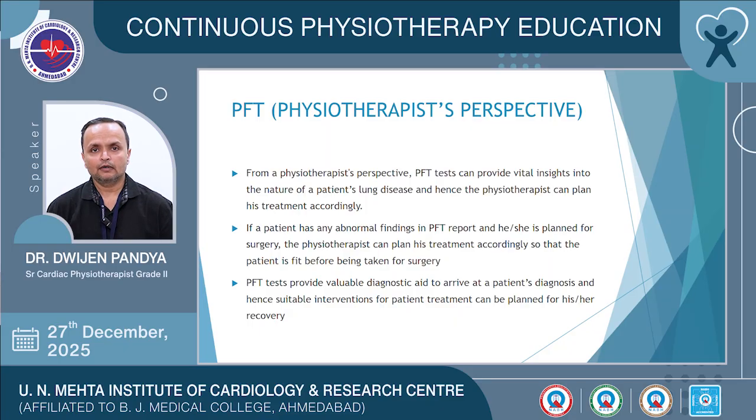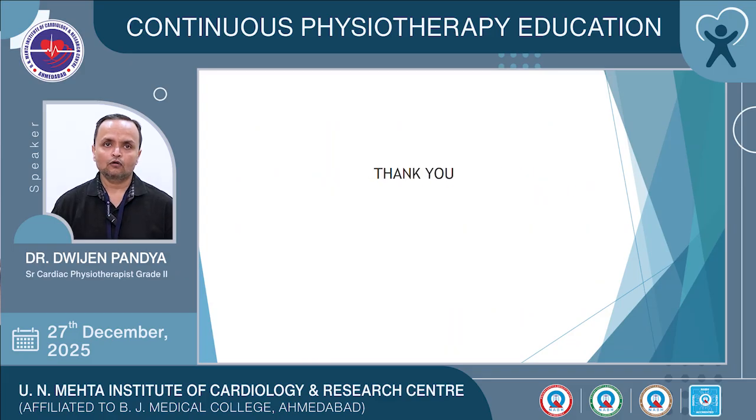PFT tests provide valuable diagnostic aid to arrive at a patient's diagnosis, and hence suitable interventions for the patient's treatment can be planned for the best possible recovery. It can be useful for perioperative status, and it can provide valuable insights to arrive at a diagnosis of a patient whose previous lung disease is not known.